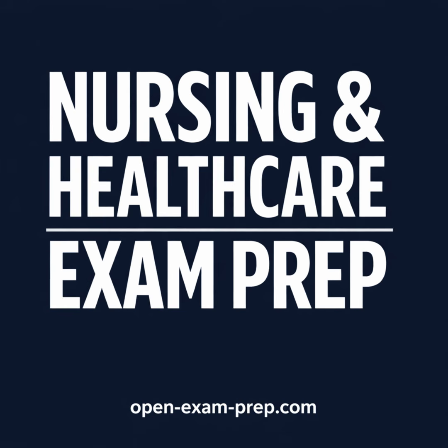The exam might also test your understanding of the additives themselves. For instance, because the PST contains lithium heparin, you cannot use it to measure a patient's lithium levels, as the additive would interfere with the result.